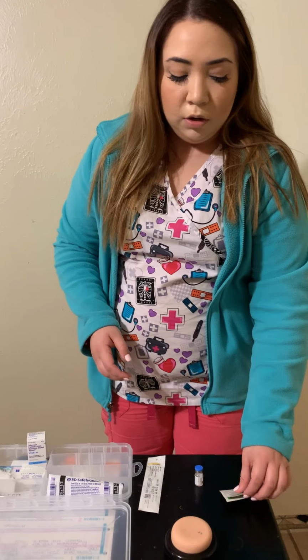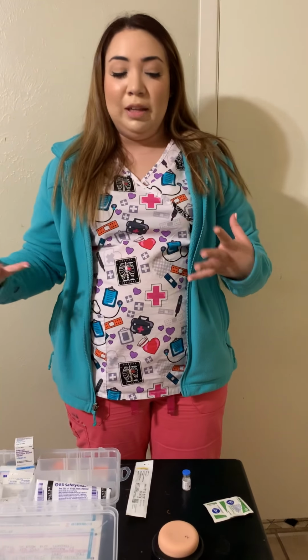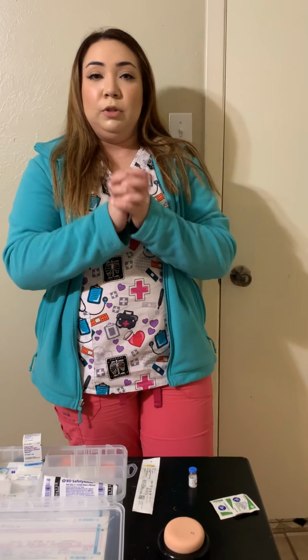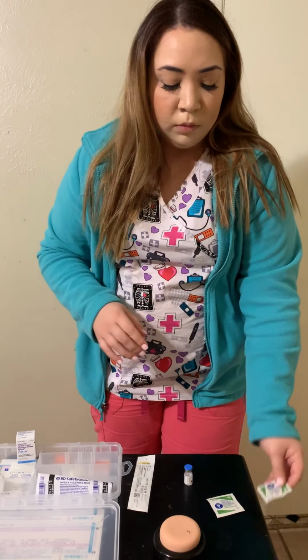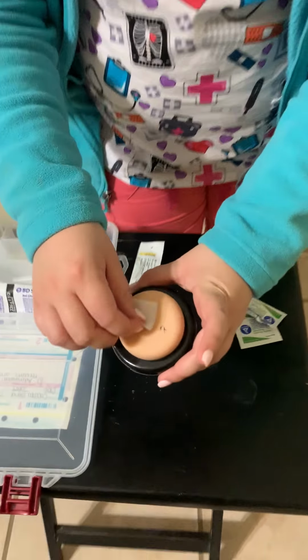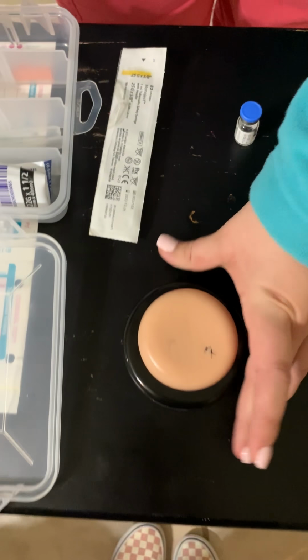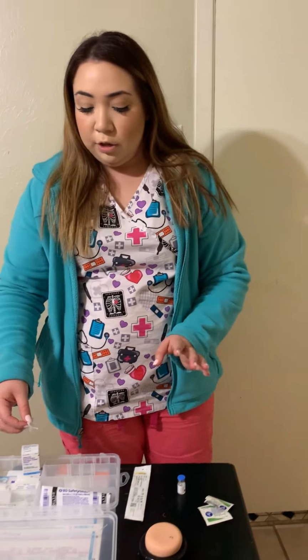With that being said, we are going to, of course, wash our hands and put on gloves. Now, I do not have gloves at this time, but we'll just pretend that I do. I'm going to take an alcohol pad and clean the area. And we'll let that air dry.